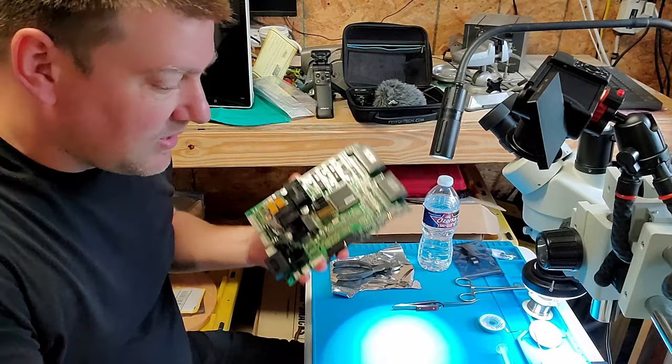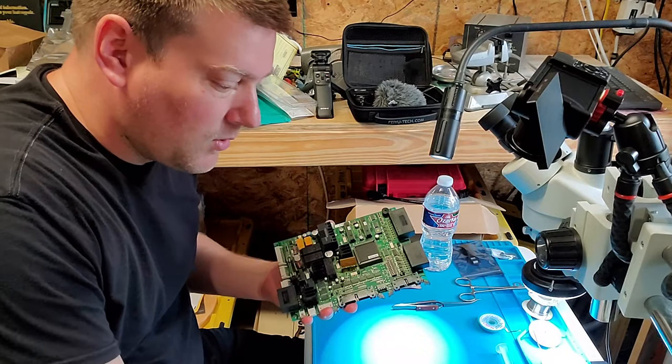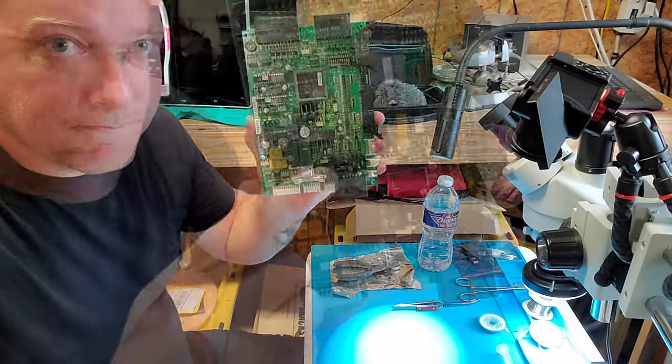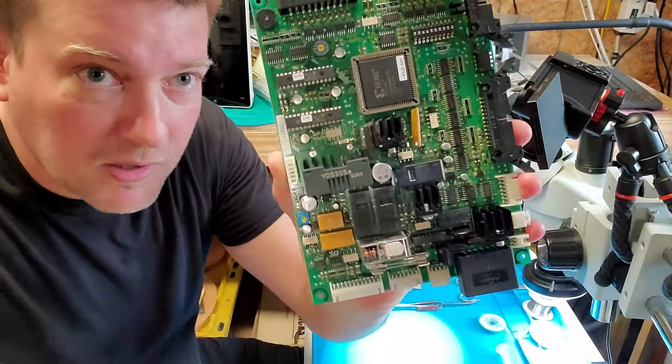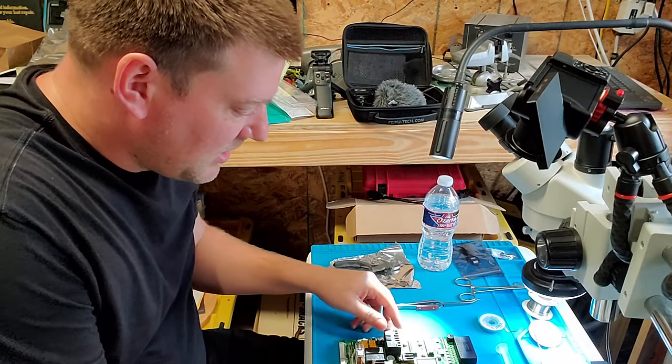But on this table, I also noticed that there is this tiny opto-photo solid-state relay. This guy is right here. You can see the dark mark on it. So what I am going to do is I have everything kind of set up right here.